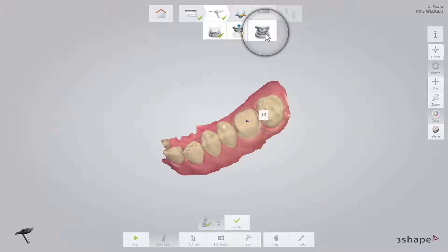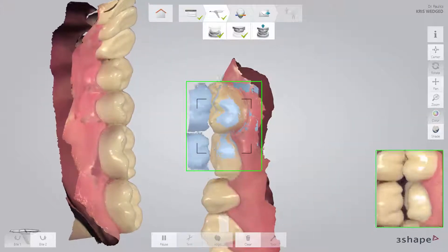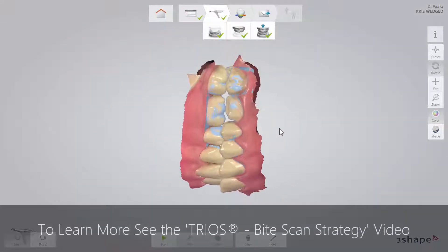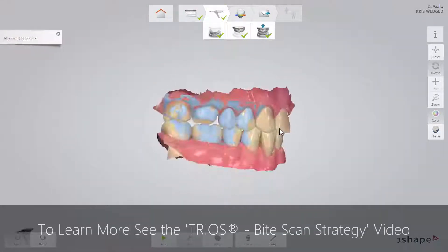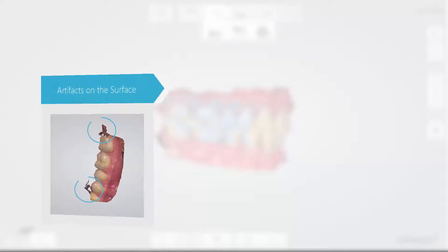Now move to the Bite Scan page. Insert the scan tip to the second molar on the buccal side and ask the patient to bite. Scan 3 to 4 teeth until the upper and lower arches snap to the bite scan. The light blue surface indicates the surface covered by the bite scan. When scanning the arches, a few things will help you obtain the correct bite: first, avoid artifacts on the molar surface, which may result from soft tissue — lips, cheek, or tongue — being scanned onto the teeth.